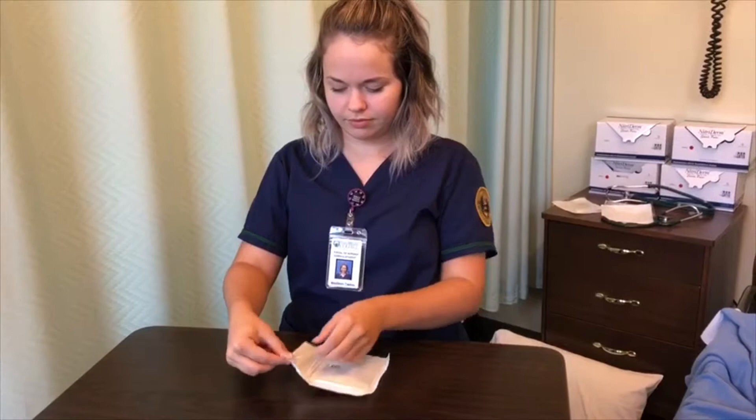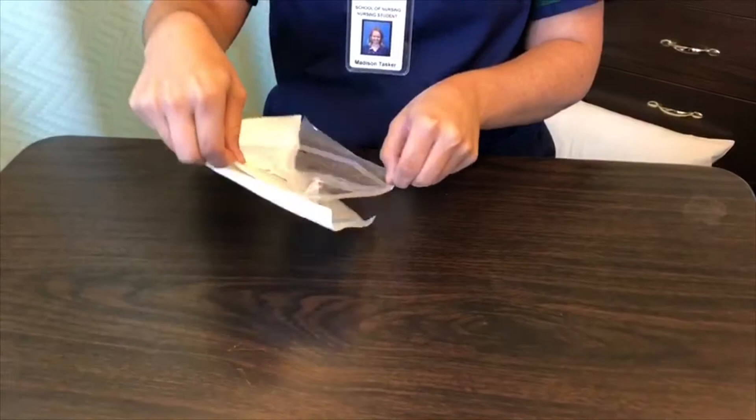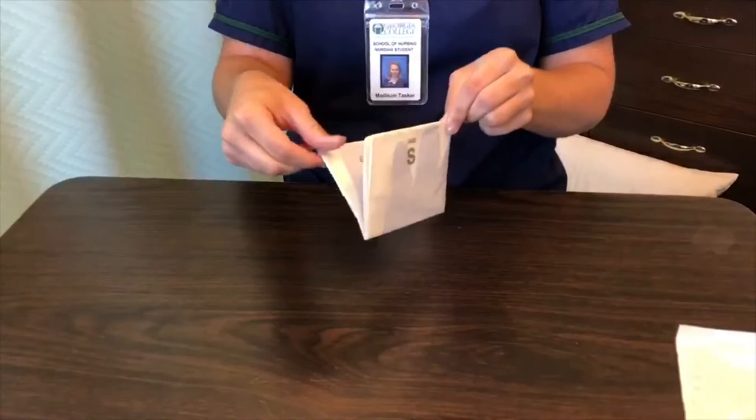Now we're going to put on the sterile gloves. She's placed the package on her clean table and is opening it. She is only touching the gloves with a one-inch border to make sure it stays sterile, and she's going to open it flat on the table.